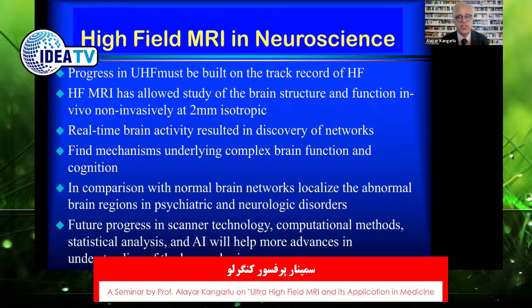So all of these questions could probably be answered if we can get more insight, in vivo non-invasive insight, into the internal structure of lesions, both formation of lesions and location of lesions, and correlation between the lesion load and disability. These are all open questions that the newer capability can ultimately bring to the table and help us address.